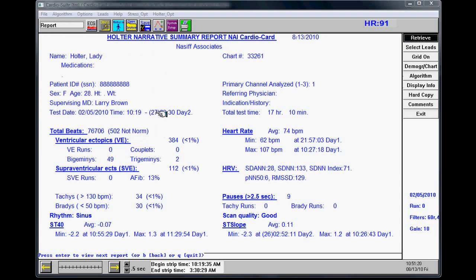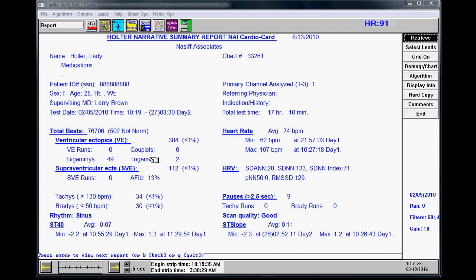This will tell you the patient's information, the total number of beats, total number of ventricular ectopics or PVCs, your VE runs, couplets, your bigeminy, and trigeminy.